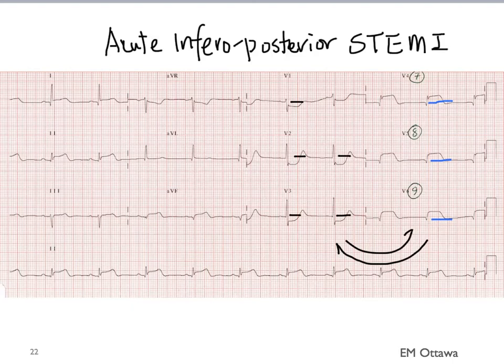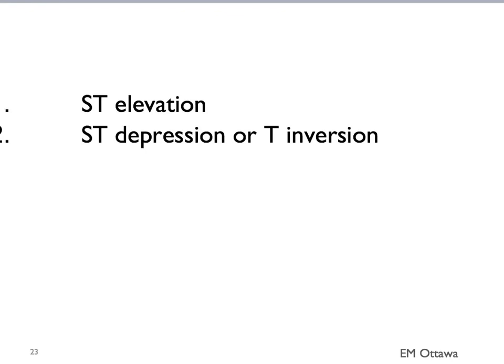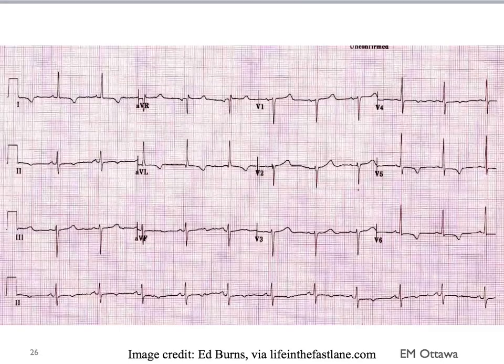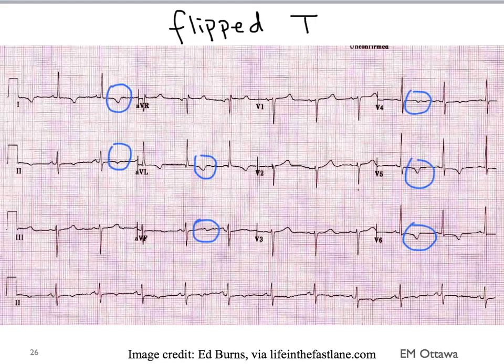After we look for ST elevation and see whether they are territorial or reciprocal on the 12-lead ECG, we then look for ST depression or T-wave inversion in patients with potential ACS. The difference with ST depression is that it denotes ischemia — it is not territorial or reciprocal like infarct. Looking at this ECG, you can see ST depressions almost everywhere; it's not territorial and not reciprocal. If there are no ST depressions, we look for T-wave inversion or flipped T's. Where do you see the flipped T's in this ECG? They are in multiple leads. If they are new, then we have to be very concerned about ischemia.